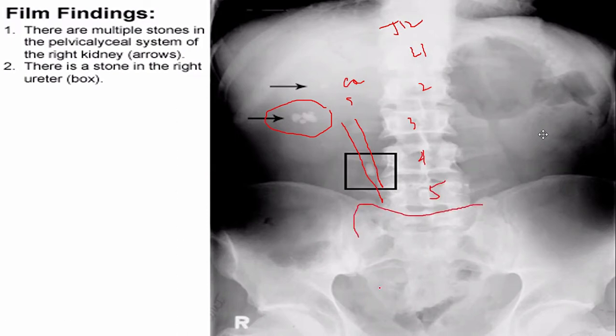Okay, Dr. Alcover, this is the sacrum. Wow, advanced topic, ha? As I told you, kaya nyo yan. Kayang-kaya nyo talaga yan. You just really need guidance. So, T12, I told you, if you try to look for the shadow of the kidney, you look for T12, L1, L2, L3. They are usually there. So this is the renal shadow. Can you see this shape? This is the renal shadow.